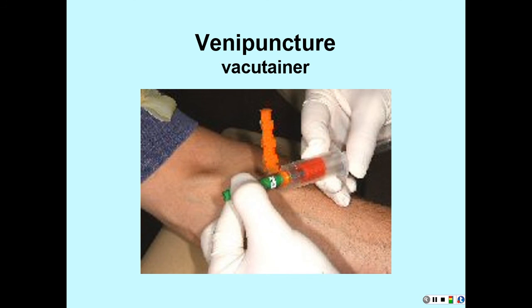So when your needle is capped, and the other end of your needle is also capped, you pull off that end cap, and then you screw your needle into this big plastic thing right here. The big plastic thing, I'm sure, has a name, but I don't know it right off the top of my head. But that's reusable.